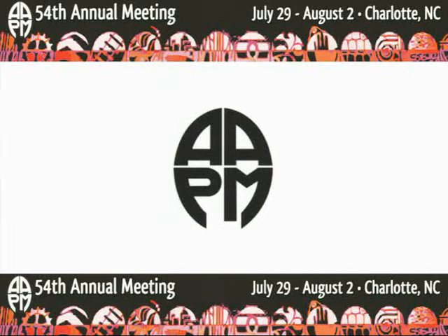Surprisingly, not at the moment. We've been in operation since the end of 2008, and believe it or not, we haven't seen neutron damage or charged particle damage yet. We did send those QA devices, each room has one, the Daily QA3, back to Sun Nuclear for maintenance as part of our service contract, but they haven't reported back to us that there is damage or anything like that.